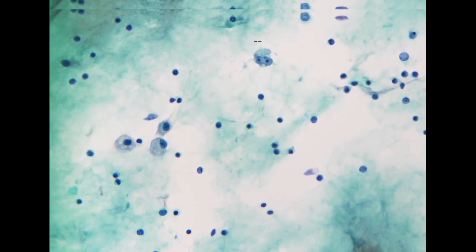Because the patient had a history and is under treatment, and we have signed out the positive specimen before, the case is relatively easy for us. If it is the first specimen, it would be very difficult for us to determine whether these are glandular cells or histiocytes, so we might need some immunohistochemistry for confirmation.